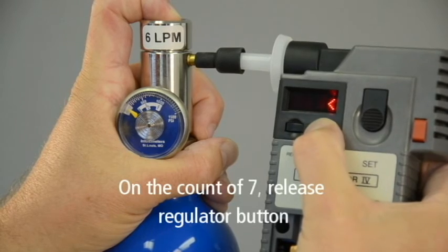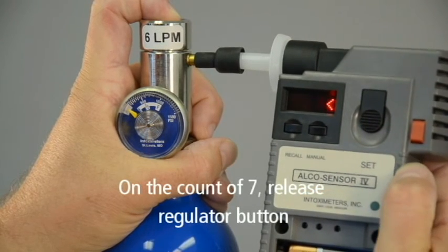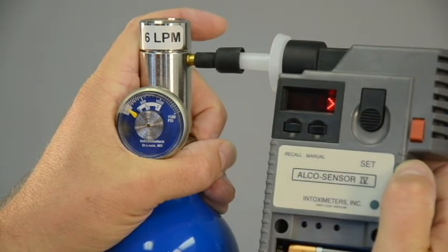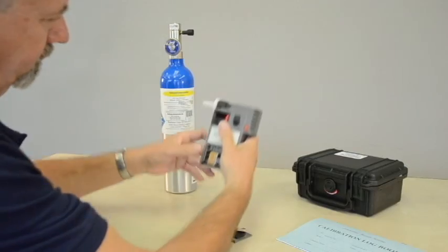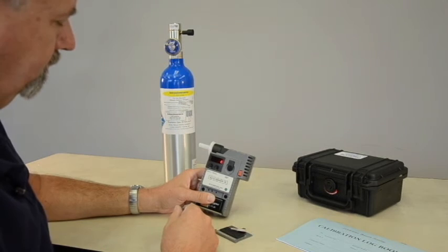On the count of 7, release the regulator button. Gas must be flowing through the mouthpiece when the manual button is pressed. Remove the AlkaSensor 4 and mouthpiece from the regulator.